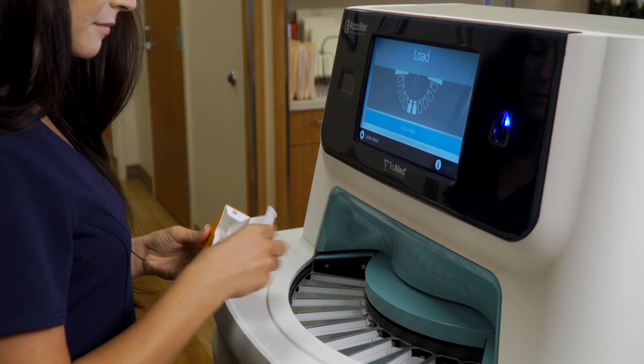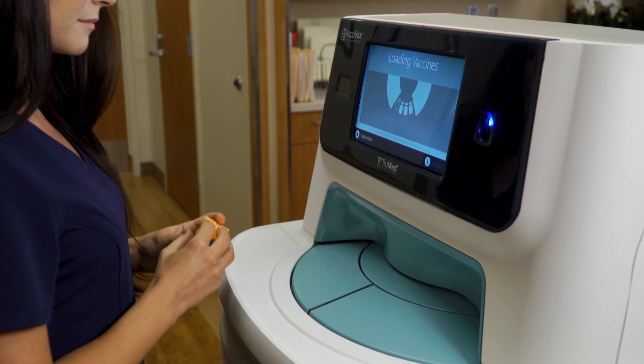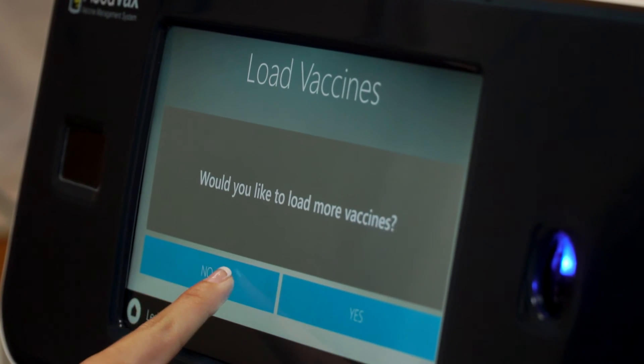When you've loaded all of your vaccines, press the load button and Acuvax's tray doors will close. Confirm that you are finished loading vaccines and you are done.